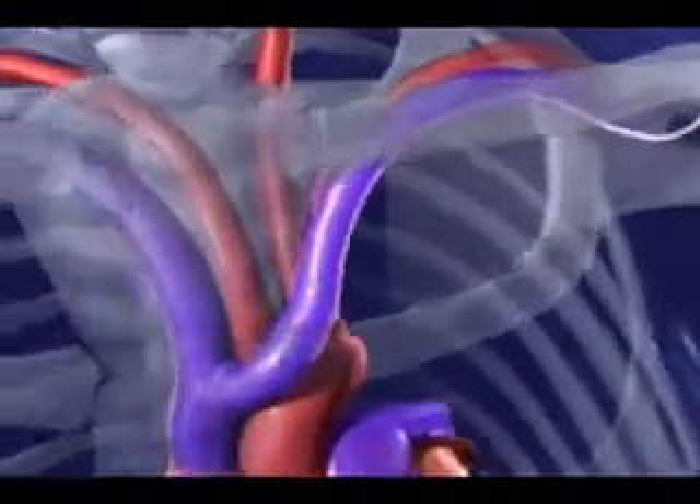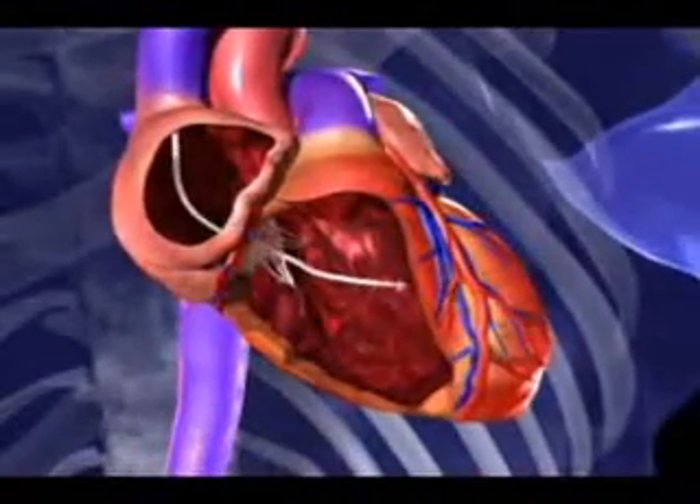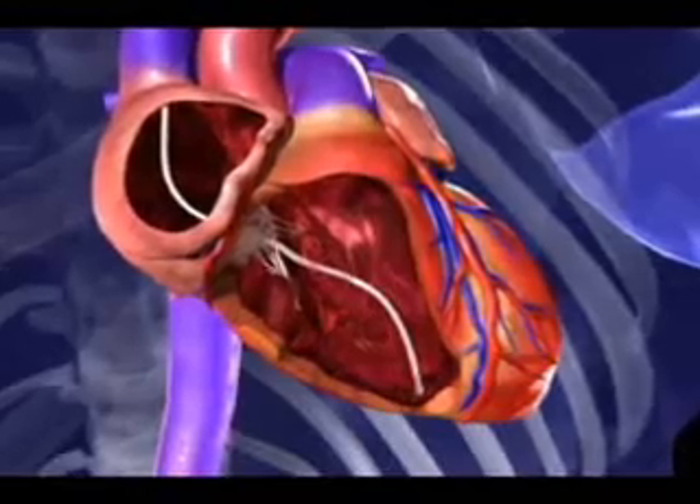The anatomical picture here shows the major blood vessels going into the heart. The blue vessels are the veins in which the first wire is being placed into the right ventricle, the lower chamber of the heart.